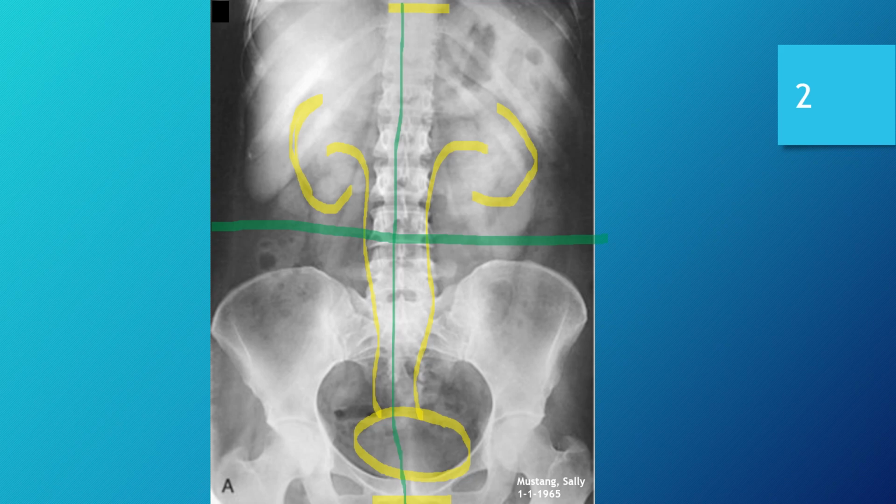My lines aren't perfect, we know that, but just what we can see with our rough estimates here. So yeah, south just a little bit towards the patient's feet, maybe about an inch, inch and a half would have been perfect right there. But other than that, the positioning for this image is very good.